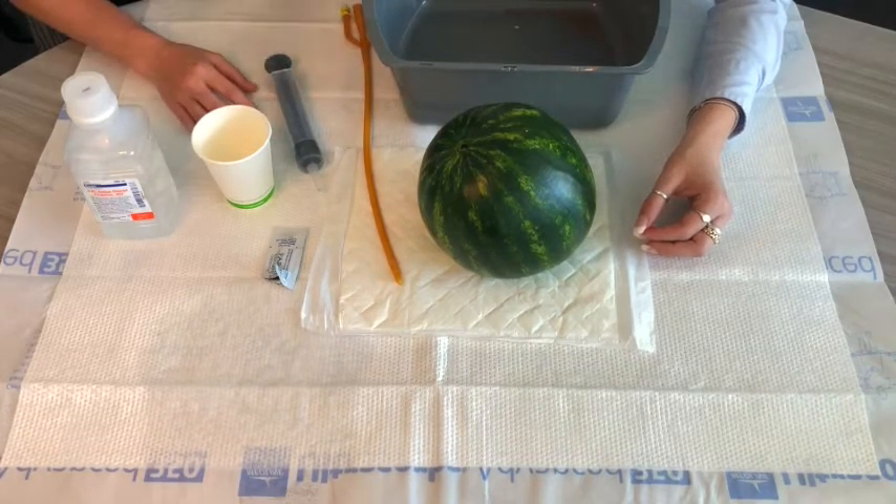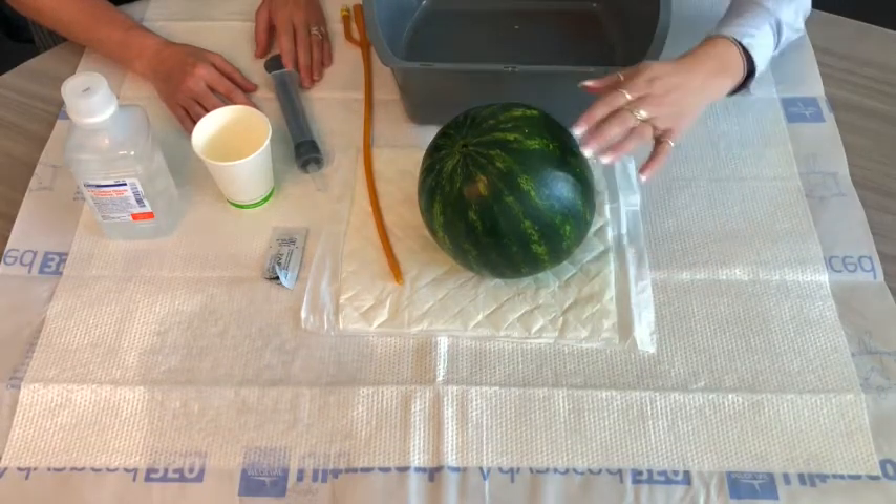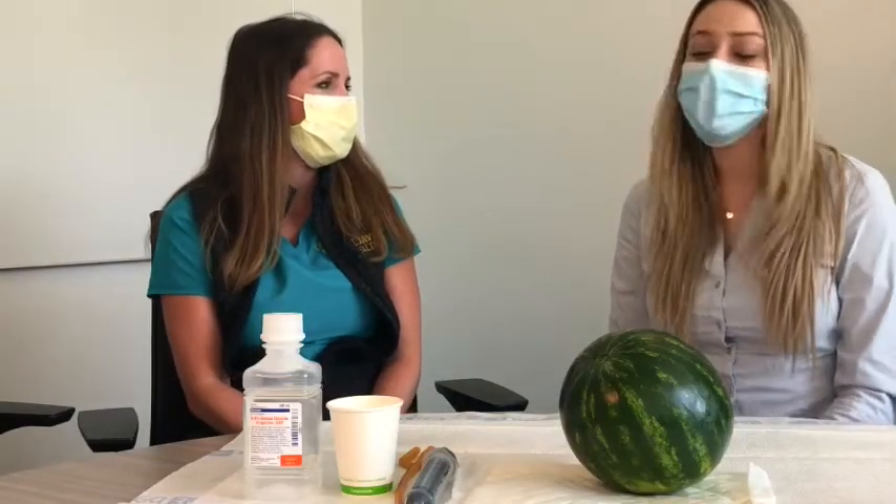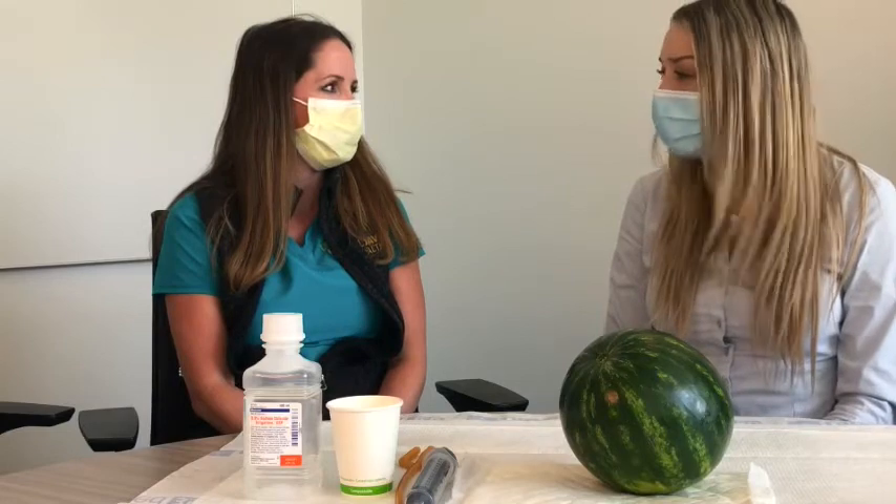Go back to your baby and feel their belly again. You'll want to make sure that it's softer and less firm than it was before. Is there anything else I should be looking out for?